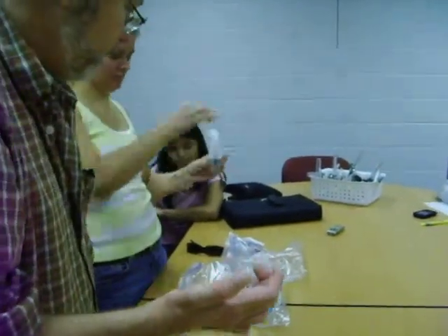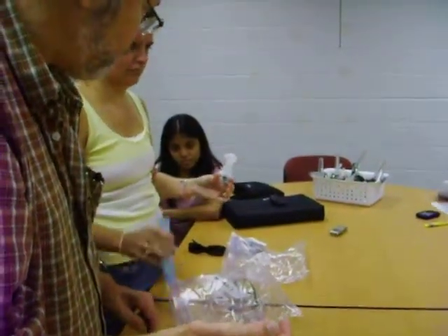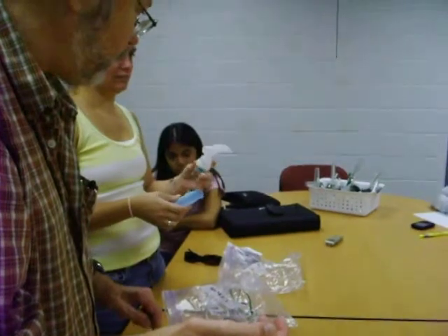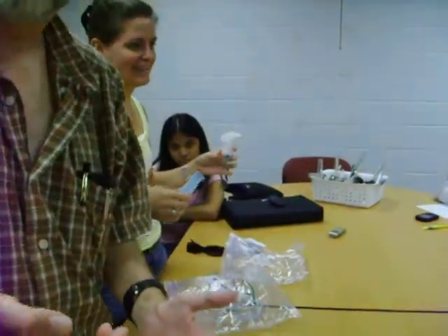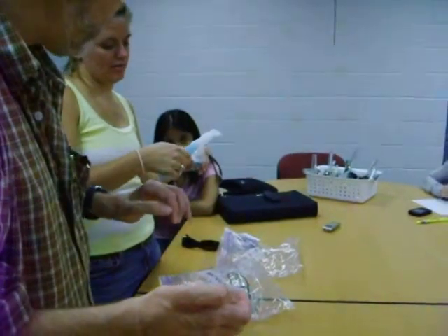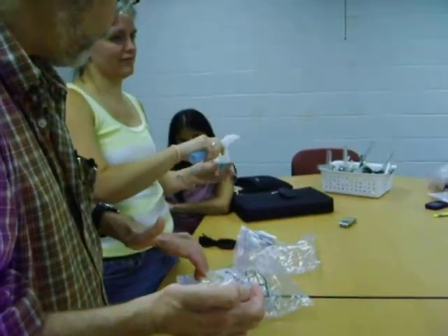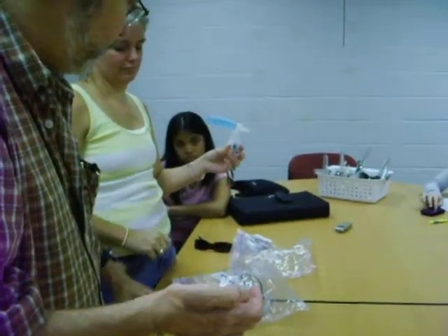Now put your reservoir on. Should the mouthpiece still be covered by the plastic? I like to keep it covered and let the patient take the cover off. I always do that if it's new or if you're working — make sure you don't touch it. Either way, you cut it. And I'm also wearing gloves. Put your tubing in.